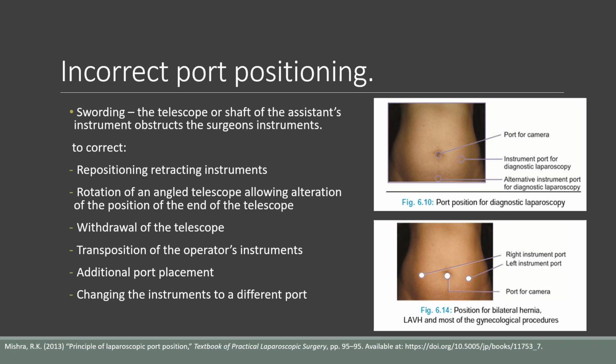Although there are a number of things you can do to correct incorrect port positioning, it's obviously advised to be mindful of the placement of your secondary ports, as putting in an additional port to correct port positioning can also increase the risk of complications. So it's important to not only have good technique of inserting ports, but also a good understanding of the anatomy and good understanding of port placement according to procedure.